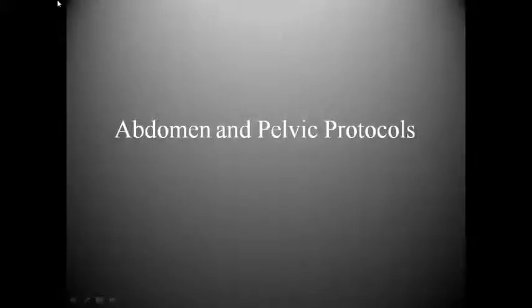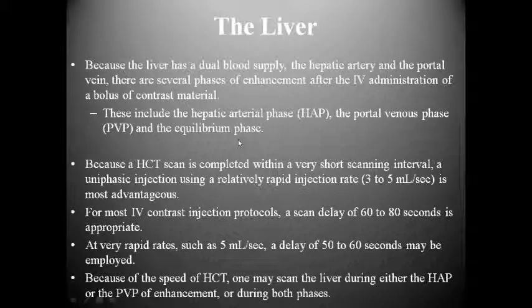Okay, abdomen and pelvic protocols. So if we first begin with the liver, we'll look at basically what comprises liver function.